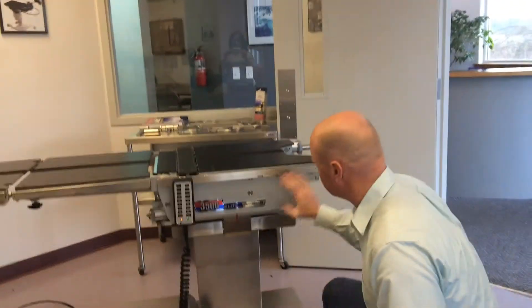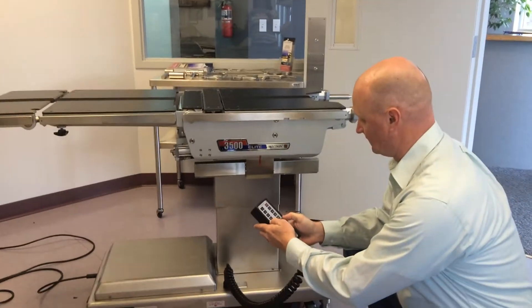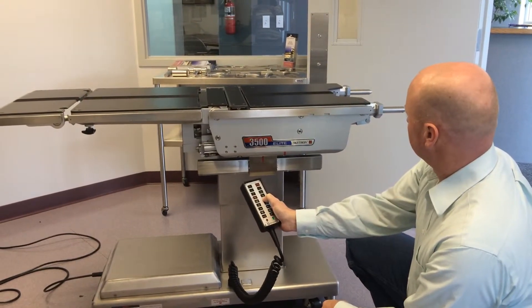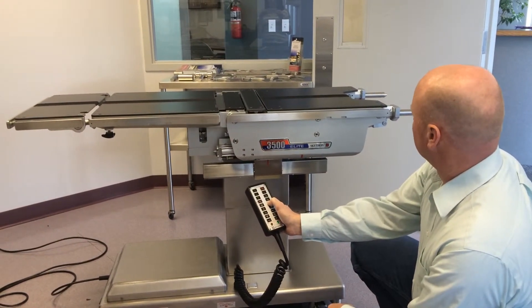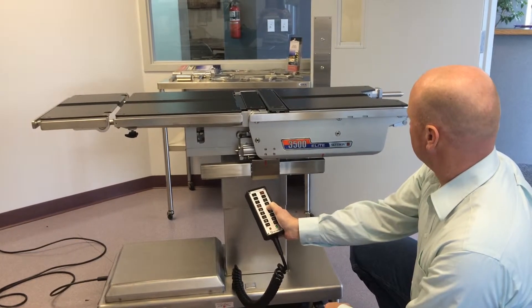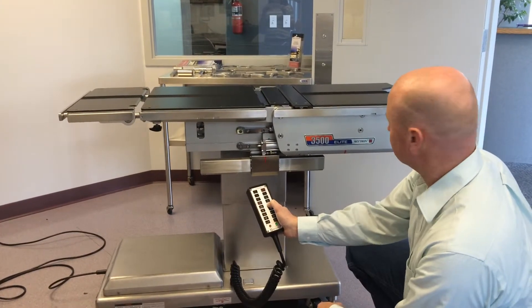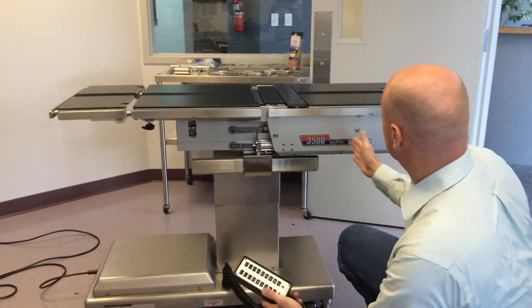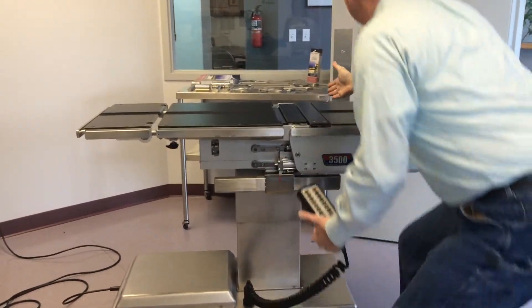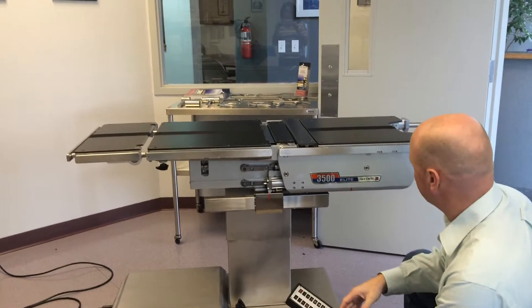Then as far as the slide is concerned, what we'll do is we'll slide that to the foot section. So depending on the positioning of the patient, that's as far as the slide you get — so you'll get from here to about here, which I'll measure that for you and provide that in my email.